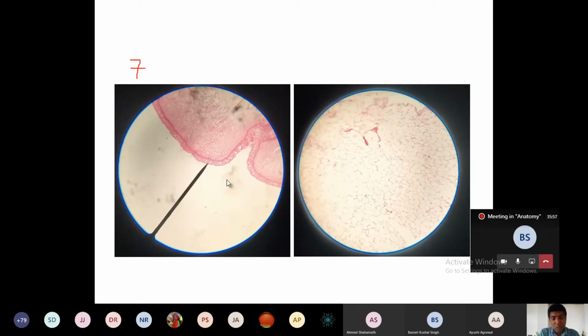So urinary bladder, urethra. Oh, sorry, ureter you can say, and if you want to say urethra, you can say the prostatic part of the male urethra. The female urethra is not lined by this; it is lined by stratified epithelium. So these are the distribution.